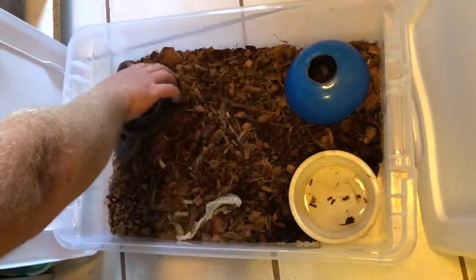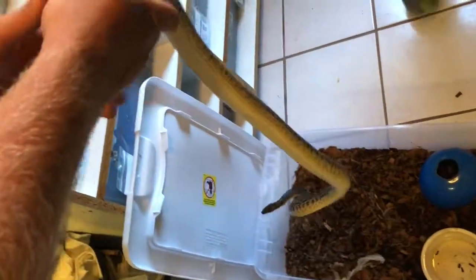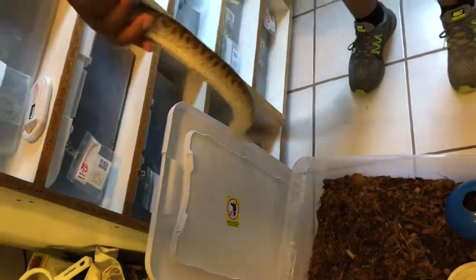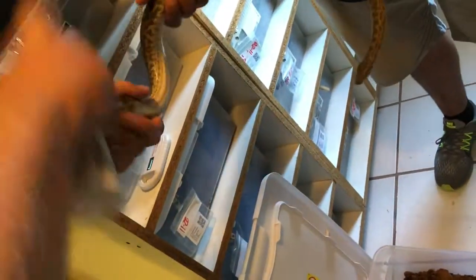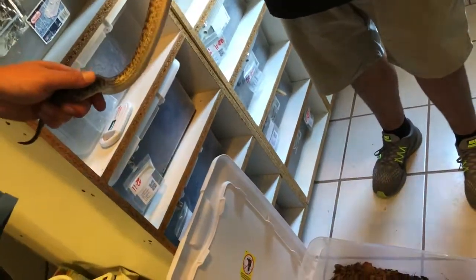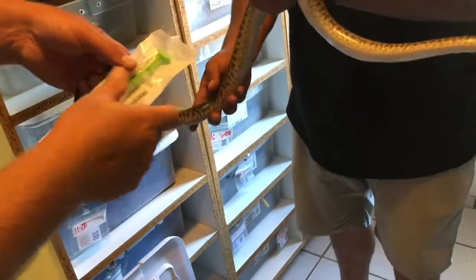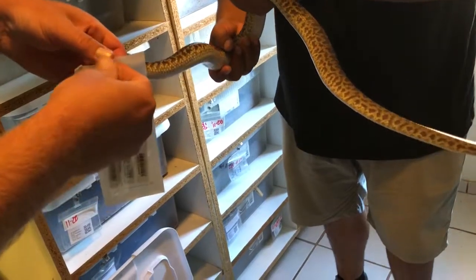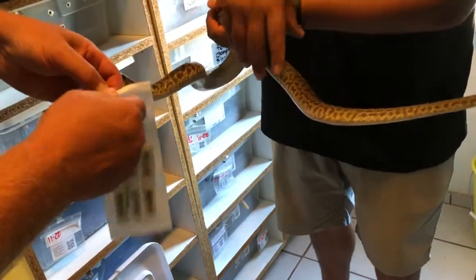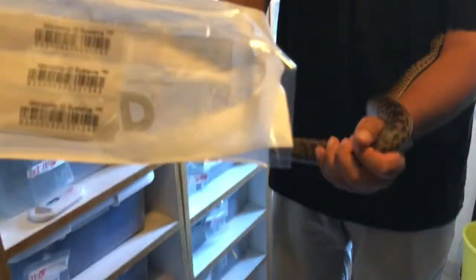This girl — you really can't tell the difference, they all look the same. So we'll do this one real quick. Beast mode spray. I get these 25 in a box, so about five to eight bucks a pop. Scan that one — it says three four three.